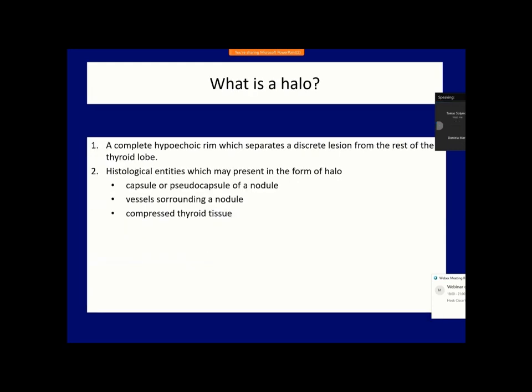First, the halo sign. This is a hypoechoic rim that surrounds a portion of thyroid tissue and thus separates it from the rest of the thyroid gland. It is advisable to maintain the name halo for cases where the hypoechoic ring is complete or almost complete. There are various explanations for the halo sign. Different histological entities may correspond to a capsule, a pseudo-capsule, surrounding capsular vessels, or compressed thyroid tissue.